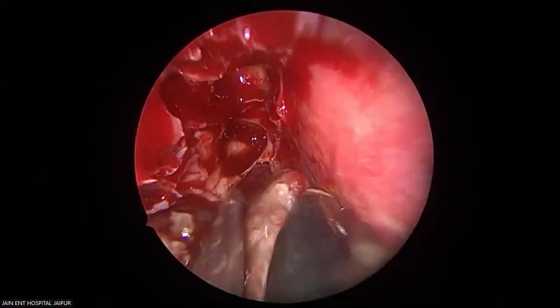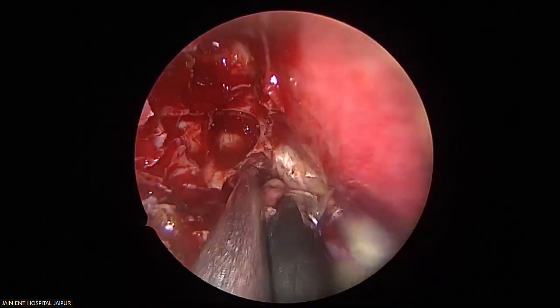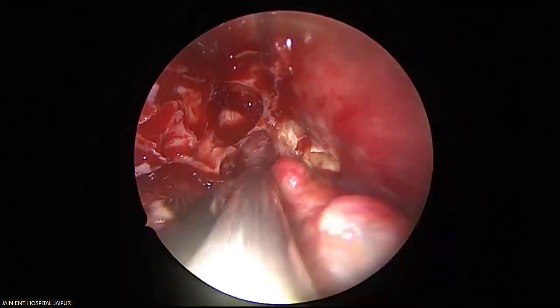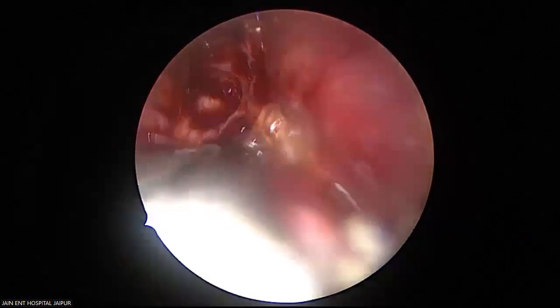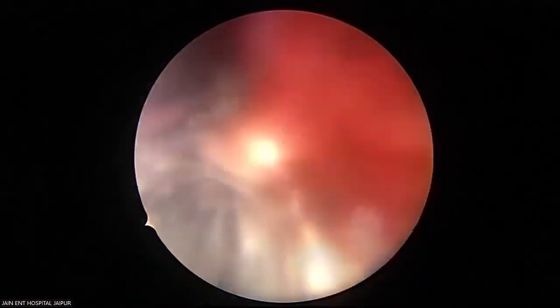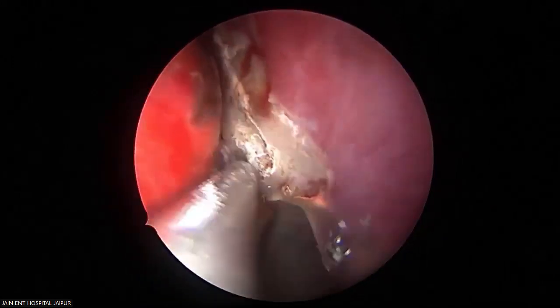So this is all now medially. See this? This is the attachment to the septum. Wherever it takes attachment, it acquires additional blood supply, periosteal blood vessels. So here I have separated from the septum.